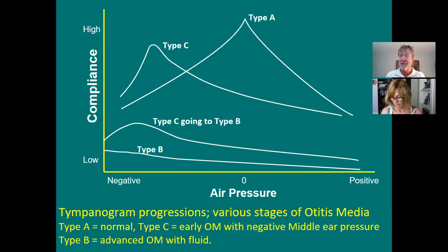He's got swollen tonsils. So now his middle ear has got negative air pressure. All right? The stages of otitis media, we're going to go through it next week, because next week we're covering outer and middle ear pathologies, disorders, and we're going to be talking about the negative tymps again. So we're crossing this way again next week, but for now, look at here.